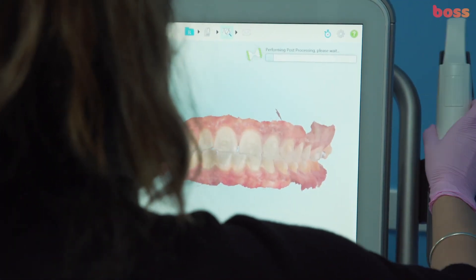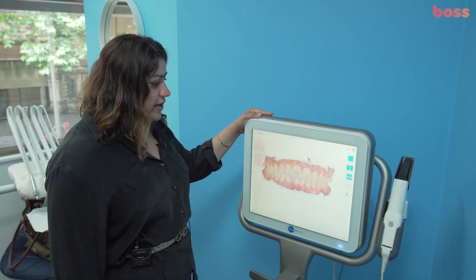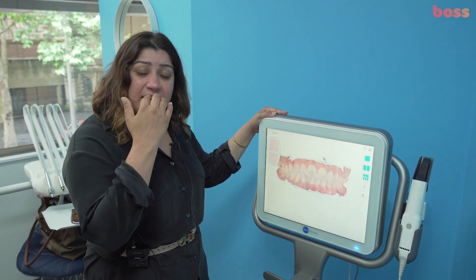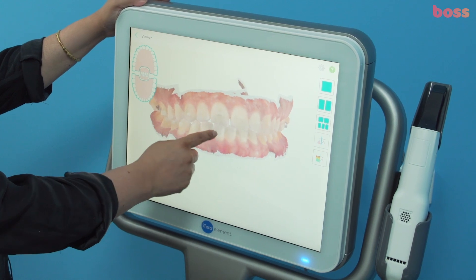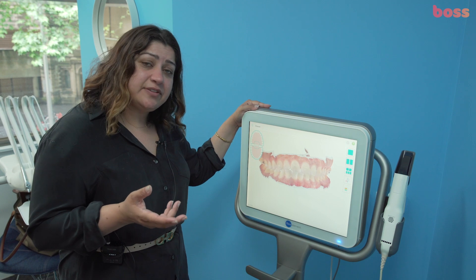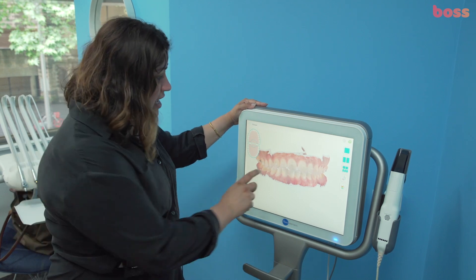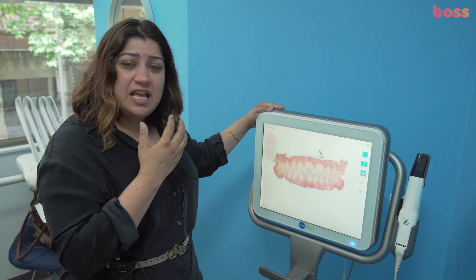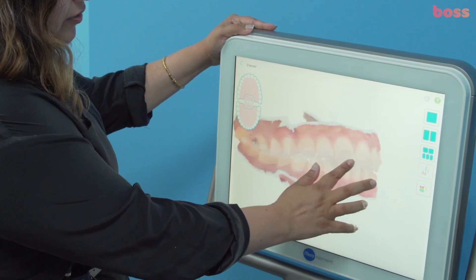The scan is all done and we've taken records for the patient. The smile shot shows that the upper incisors have extruded a bit. This was a mild open bite case, class 3 with asymmetry — you can see the upper and lower midlines don't meet. We decided the objective was to accept the midline and not try to correct it, because the patient preferred a shorter treatment time.